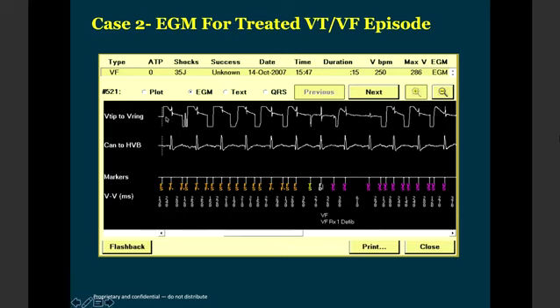If you look at the electrogram, this is the tip to ring, the near field ventricular electrogram. This is the far field ventricular electrogram. You see there are multiple unnecessary signals being sensed by the near field electrogram. To the contrary, if you see the far field EGM, it is a very clean, pristine far field signal. But the device will only go by what is counted by the near field electrogram. This is what is reflected in the marker channel, not the one which you see in the far field channel.